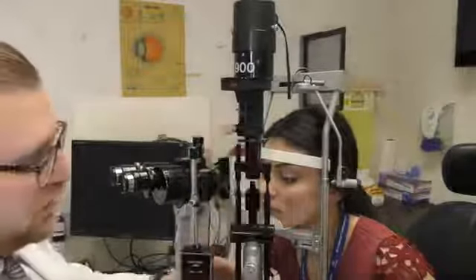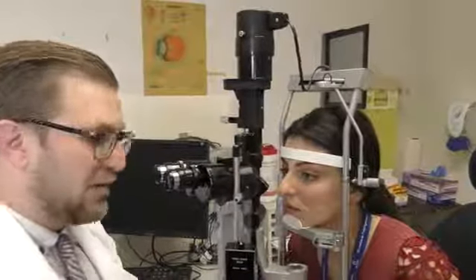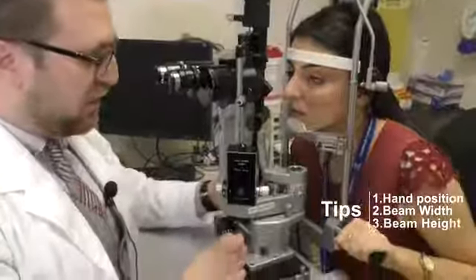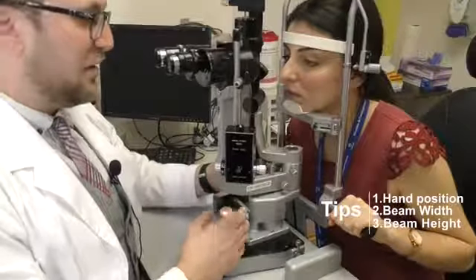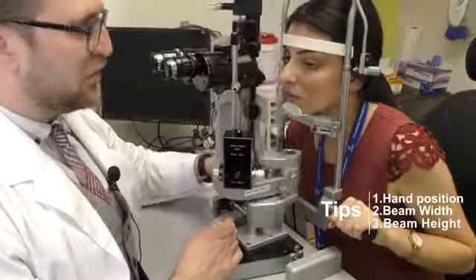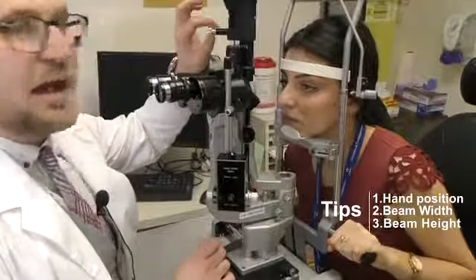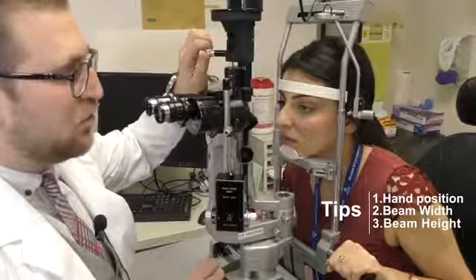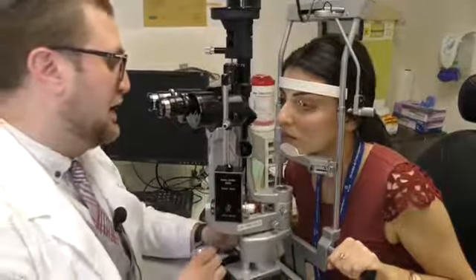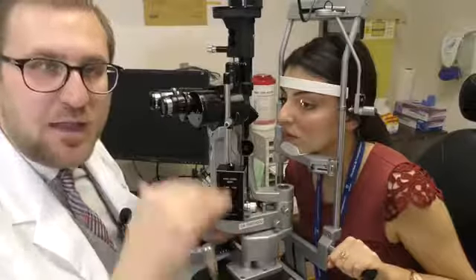So now, what I want to do is review the 3 most essential elements of the eye exam that we talked about. So again, positioning: your right hand on the joystick, left hand on the light source, okay? That's one. Two is rotating the light source with your hand here, and also widening the beam, either wide or narrow. And three is the height of the beam, which is just done up here, okay, to make it short or to make it high. So again, those are your three most essential elements of the exam: how to widen the beam, how to position yourself, and how to make it higher or shorter.